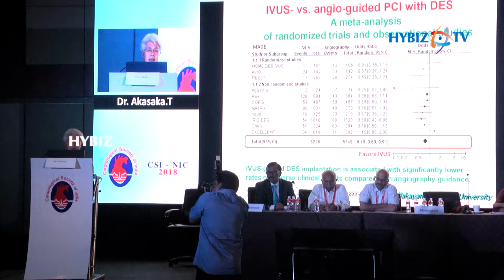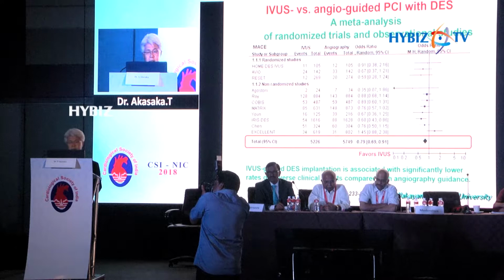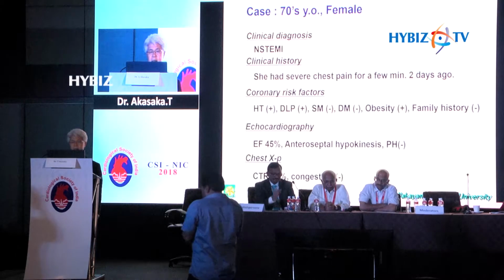And this is a meta-analysis demonstrating how IVUS is better than angio guidance, as shown in this slide. All the data demonstrate that IVUS-guided PCI might be better than angio guidance, as you know very well.